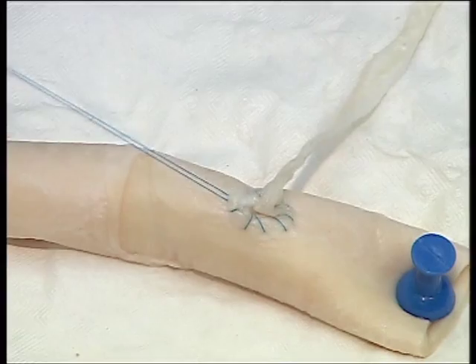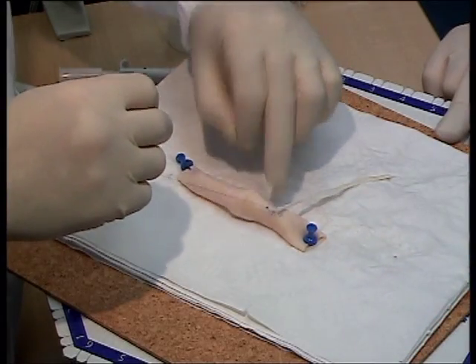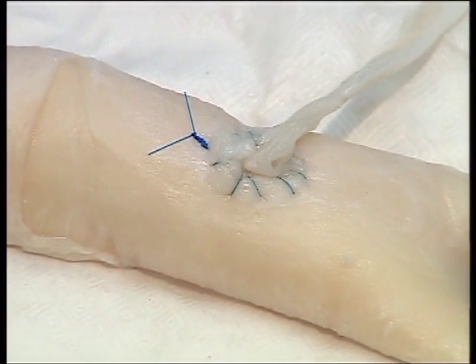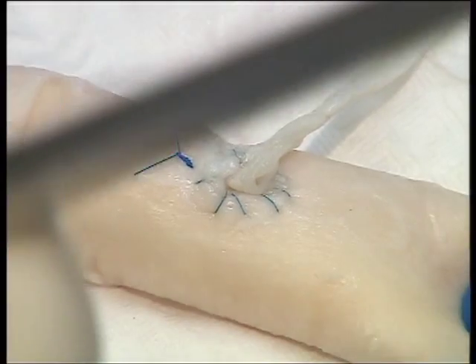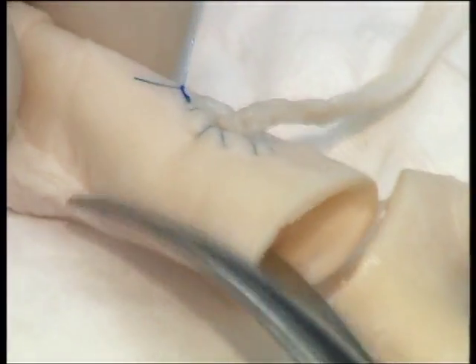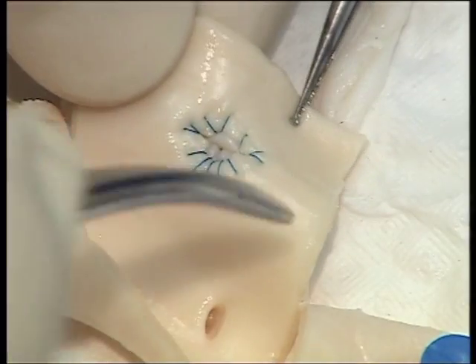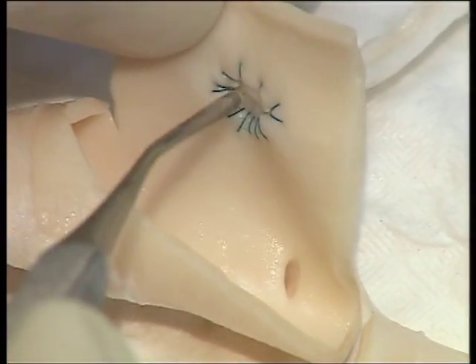The anastomosis is secured with a knot. The anastomosis is inspected externally, and then the aorta is transected to enable the anastomosis to be assessed from the inside. Check for spacing of the sutures and full thickness bites, and pass a probe from inside into the conduit to confirm patency.